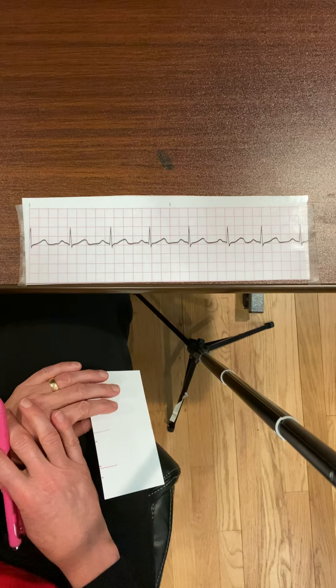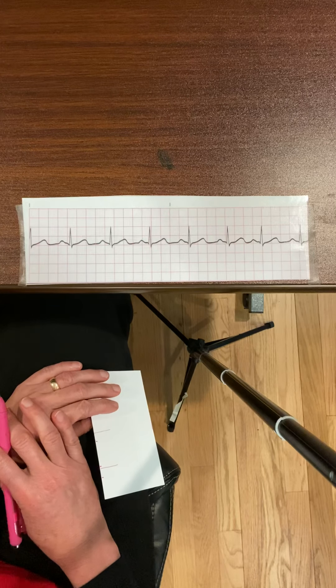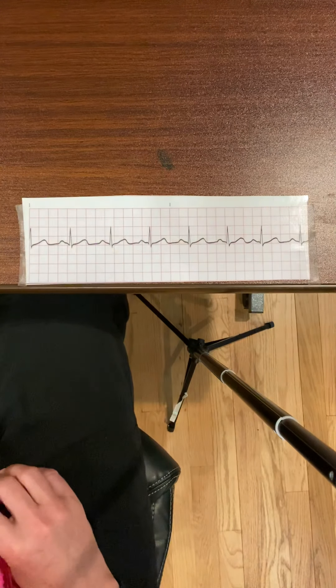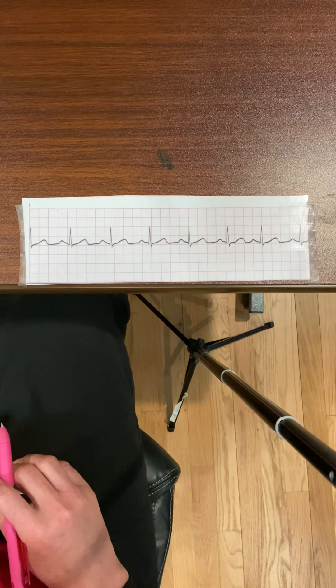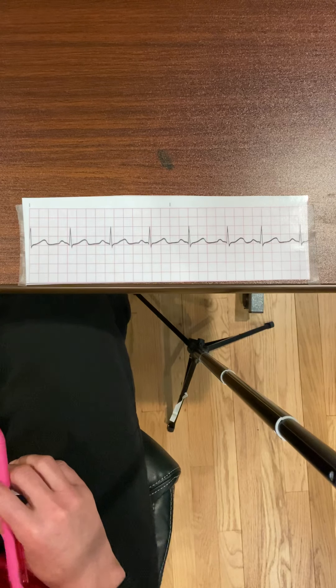I can say this is normal sinus rhythm because: the heart rate is 80 bpm, which is within normal sinus rhythm range; the rhythm is regular; the P waves are consistent, upright, and there's one before every QRS; the PR interval is 0.2 seconds, within normal range; the QRS complex is 0.08 seconds, within normal range; and the ST segment is isoelectric. I'm confident this is normal sinus rhythm.